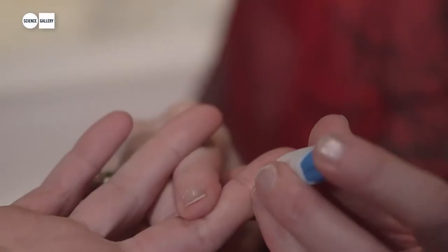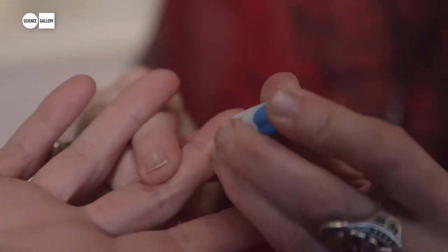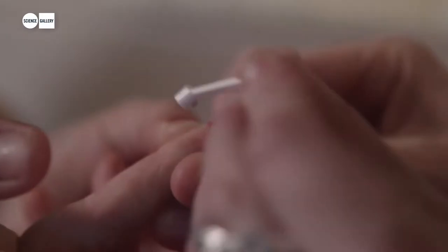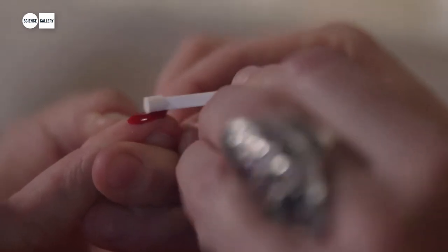This is MyType. MyType is an evolving visual display of the blood group reactions of visitors to the Science Gallery. When a visitor comes in to the MyType exhibition they can get their blood group done. With just four drops of their own blood we can determine what ABO group they are and what rhesus group they are.